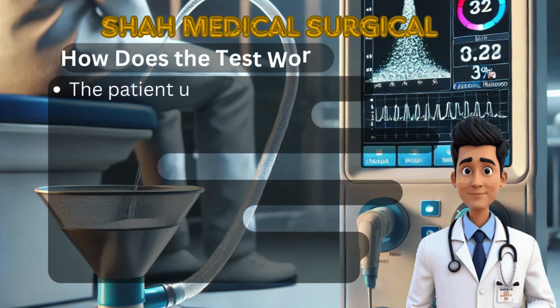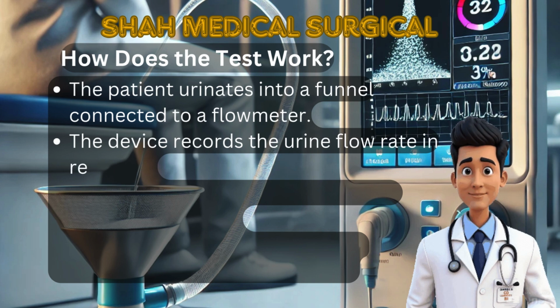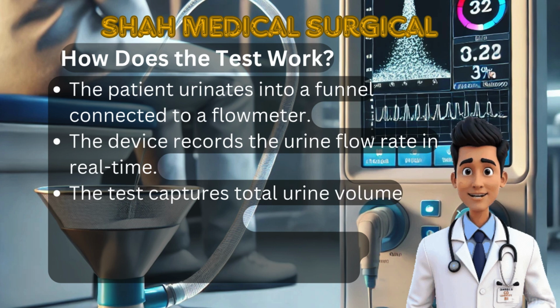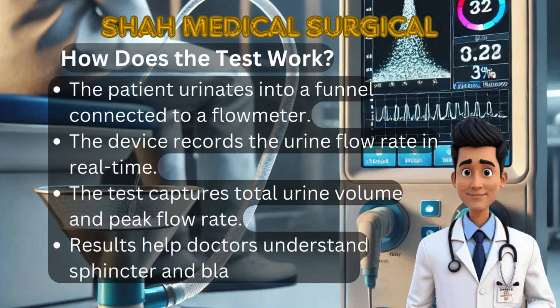How does the test work? During the test, the patient urinates into a funnel connected to a flow meter. This device records the urine flow rate in real time, tracking every drop of urine. It captures the total urine volume, peak flow rate, and overall voiding pattern. These results help doctors determine if the bladder and urethra are functioning properly.